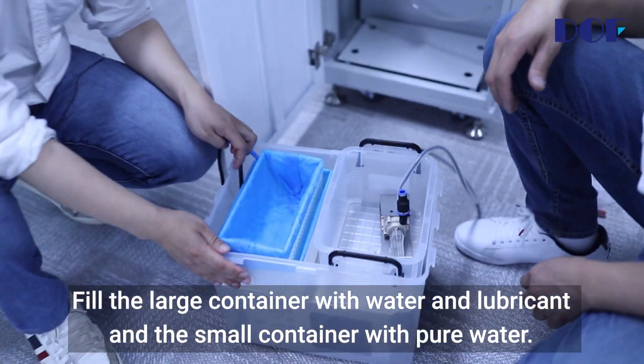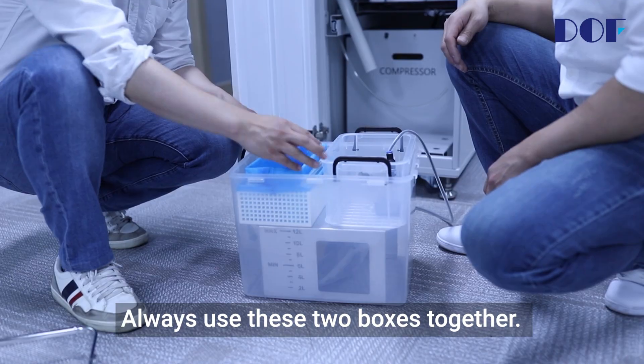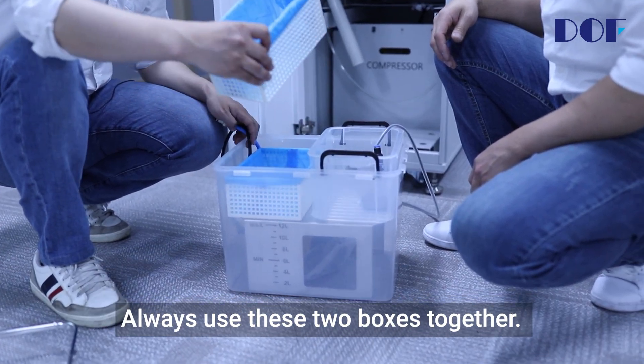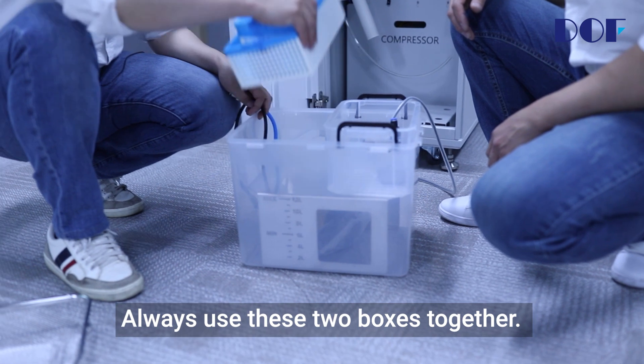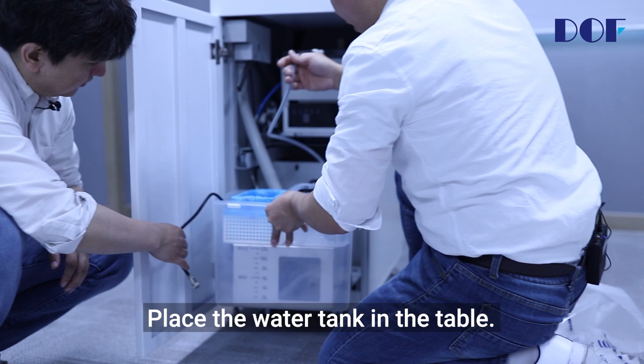Fill the large container with water and lubricant, and the small container with pure water. Always use these two boxes together. Place the water tank in the table.